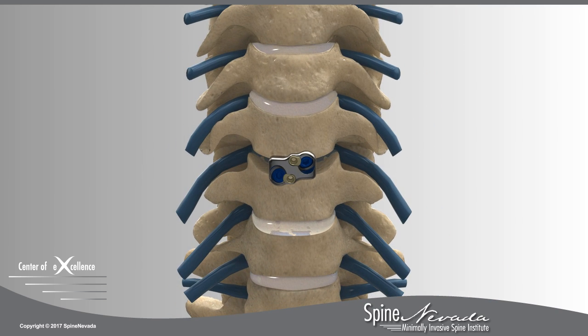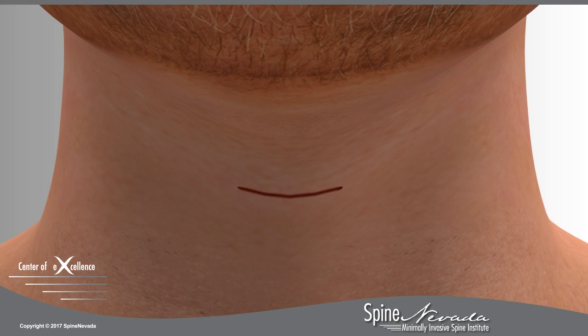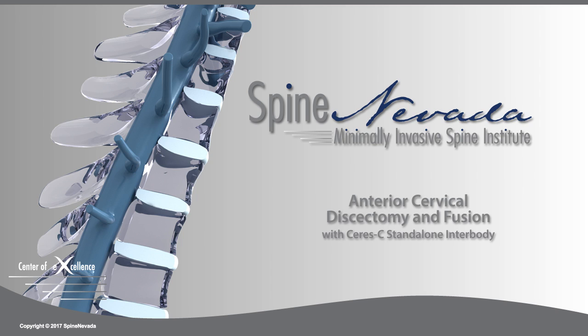Over time, the graft material will fuse with the vertebral tissue above and below, forming a bone mass called fusion. The wound is closed with absorbable sutures and a tiny dressing applied. At Spine Nevada, this procedure is performed in the outpatient surgery center or hospital.